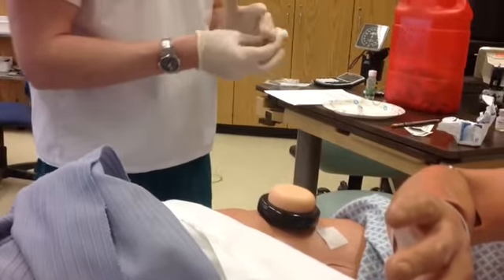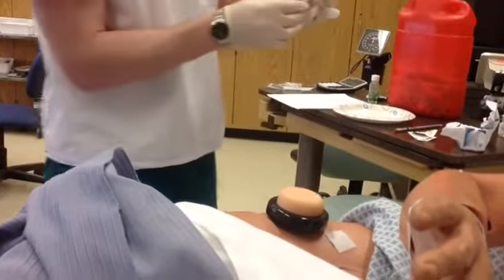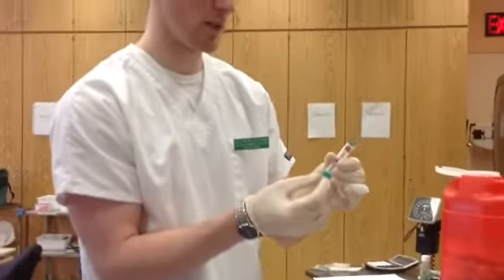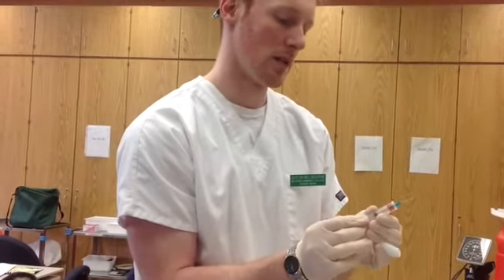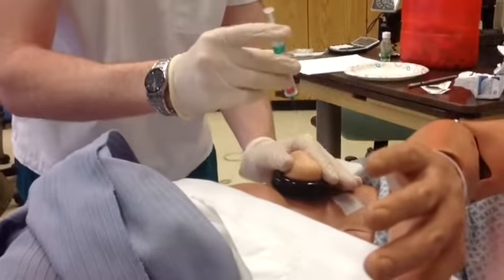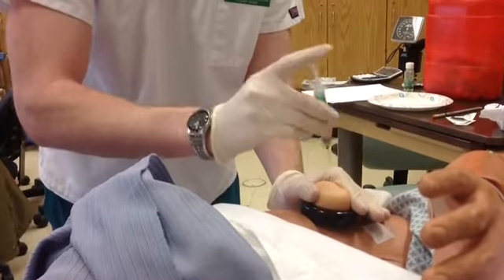I'm going to place the gauze between my 4th and 5th finger. Expose my needle. Because it's intramuscular, it's going to go at a 90-degree angle, and it's going to be bevel up. So squeeze my site. 1, 2, 3.